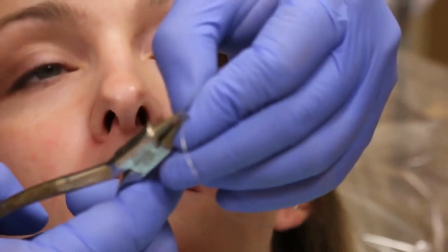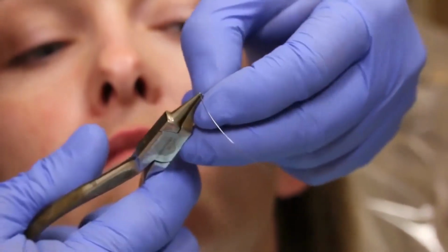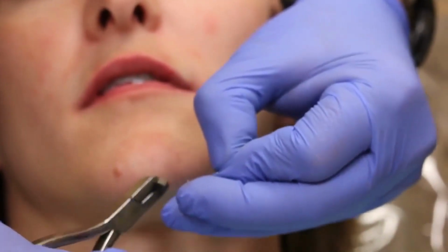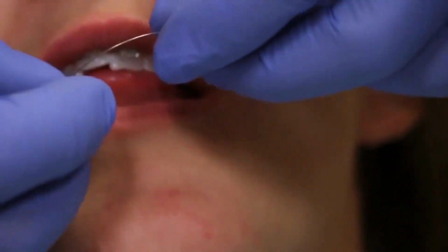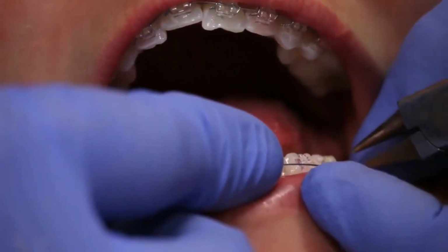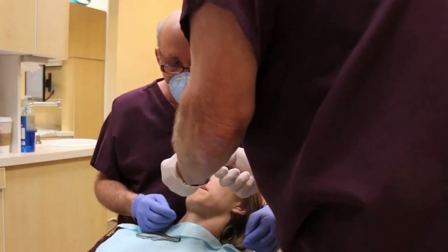I bring the plier out, I hold the plier again at the dot, not using the tip so it doesn't come out of your hand, and bend really tight, and you will have a definite bend on your Nitinol. Then I just cut behind that bend, and we get a little L-shape bend that will hide behind the bracket, and it's not going to hurt our patient. I place the wire again, to confirm that my bend is in the right place. And then you can have your assistant grab the wire exactly where you want to and bend it for you.